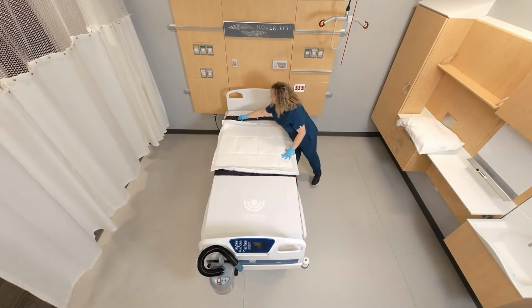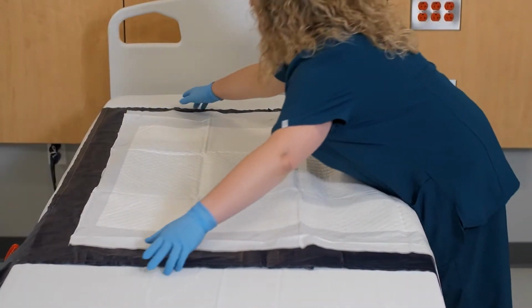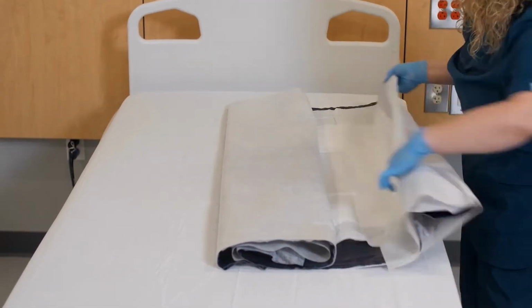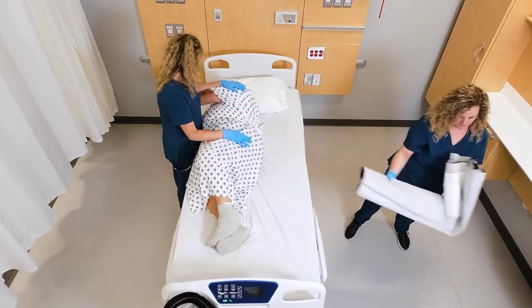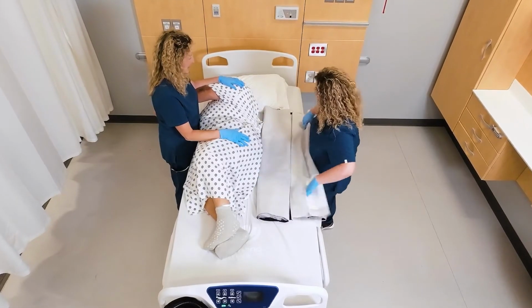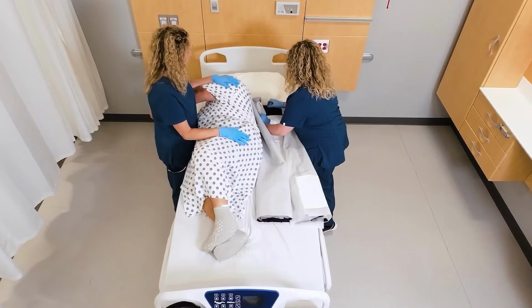If the patient is already on the bed, use a log rolling technique to place the Q2Roller with two caregivers. First, open the Q2Roller and find the center line. Fold the product to the center line. Bend the patient's knee and roll them onto their side with one caregiver stabilizing the patient while the other caregiver will place the Q2Roller. Align the center of the Q2Roller with the middle of the bed and the top edge with the midline of the patient's ear.